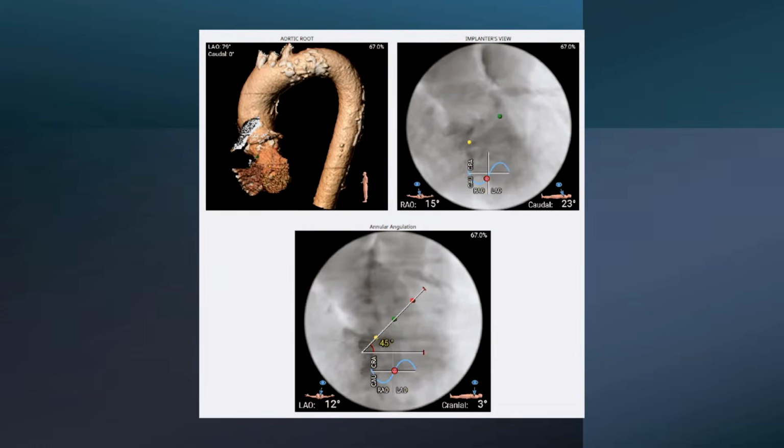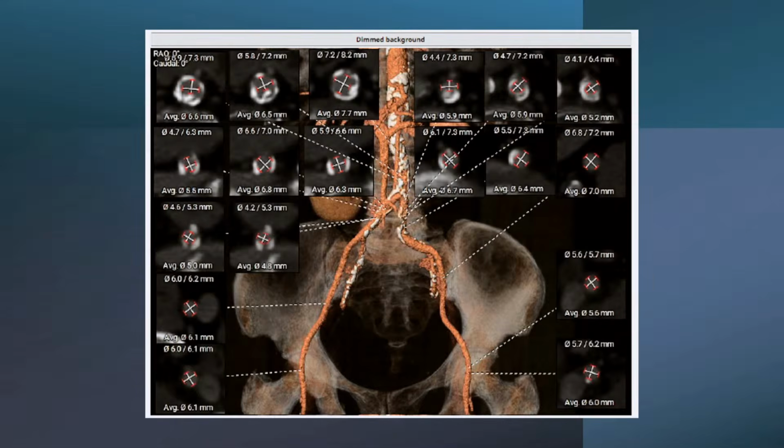And the angle we got was around 40 degrees, so that's comfortable, not too horizontal. But now this is very important. This is the iliacs, common iliac, bilateral iliacs, and the femoral arteries. If you can see, especially in the left upper corner, the whole quadrant is severely calcified, or a concentric calcification is present. Severely calcified vessels, and they are quite narrow.